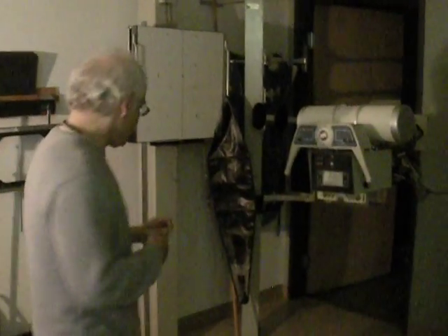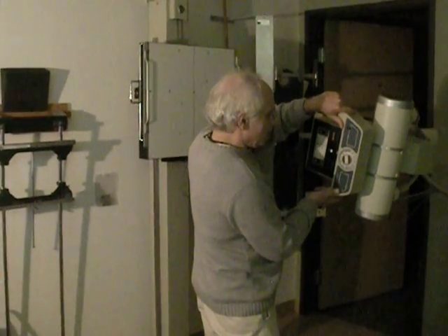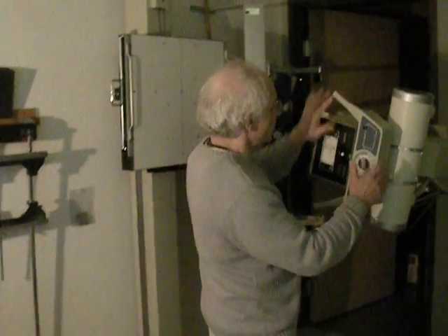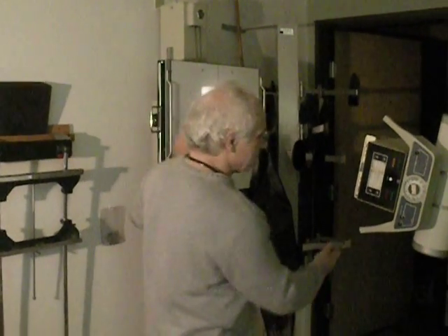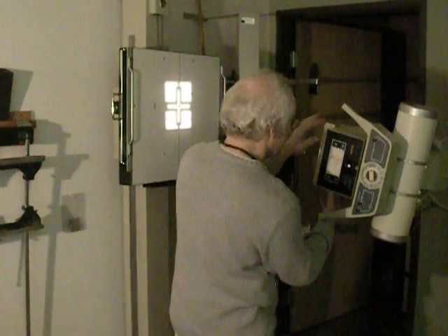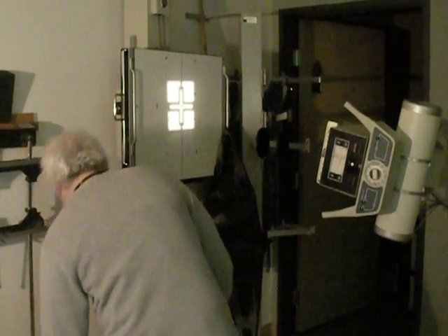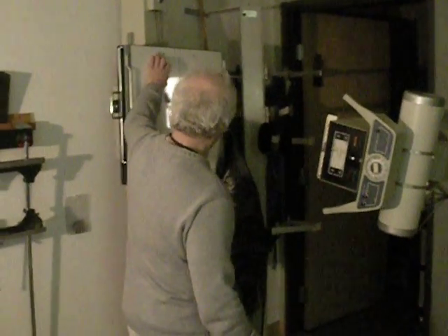So all of these things we know will be true. That this is going to be at a 40-inch SID. It's going to be on an 8x10 in the bucky, and for demonstration purposes we're not going to place films in this, so I'm collimating inside of 8 and inside of 10, and that would be sufficient collimation, and I could collimate more if I like.